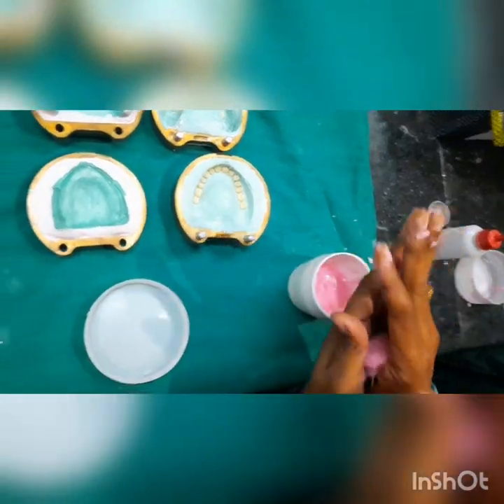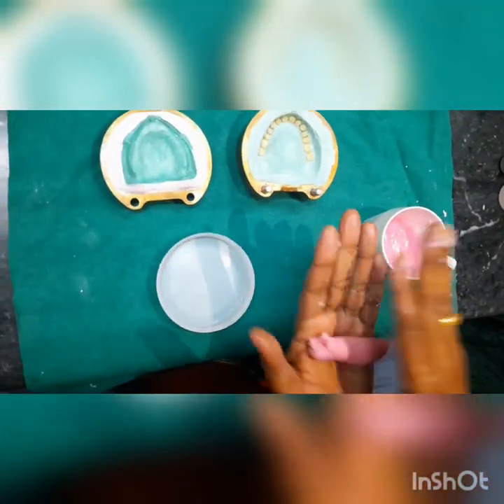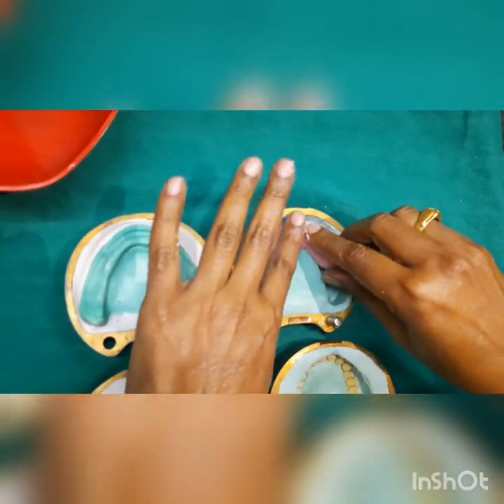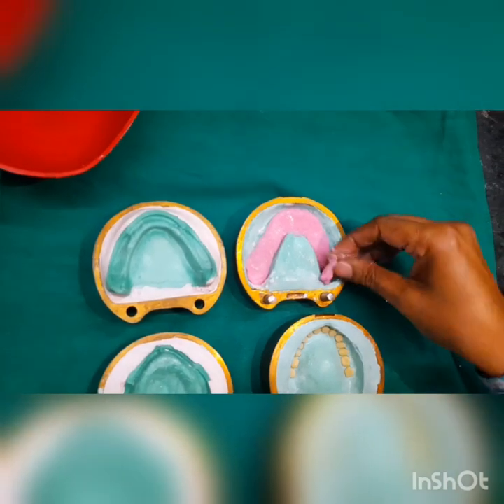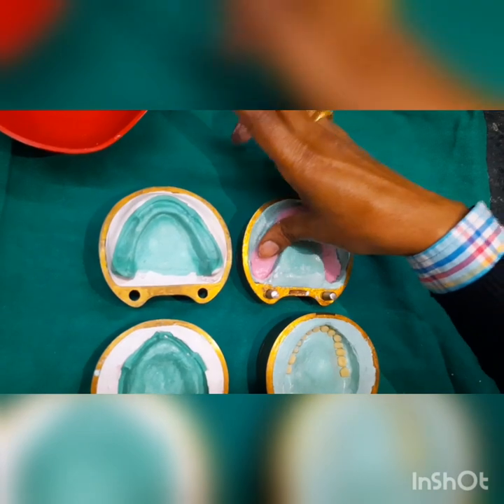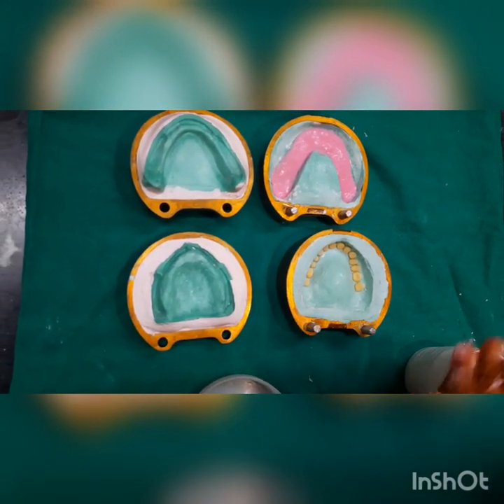We will take the mix, form it in the shape of a rope, and apply it like this. You can see the dough — we are going to squeeze it in a horseshoe shape in the lower area of the lower mold.